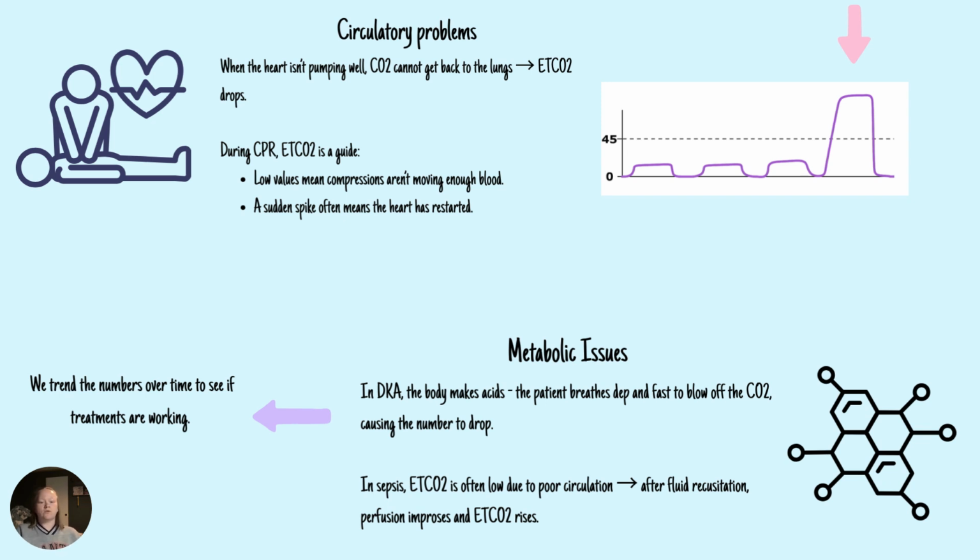In patients who are septic, end tidal is often low at first because the circulation is poor. So once fluids improve that perfusion, that end tidal will rise.